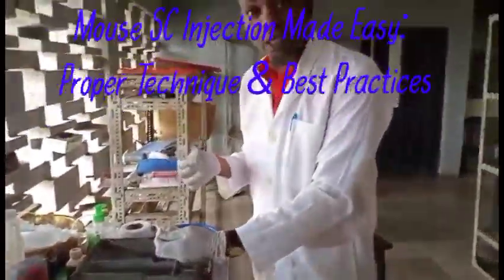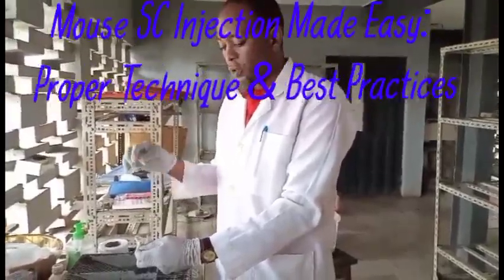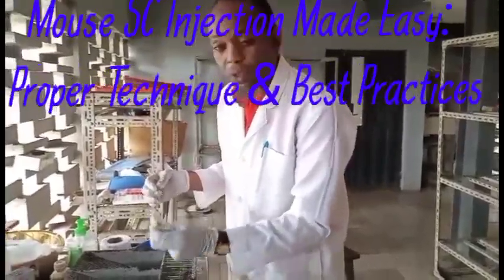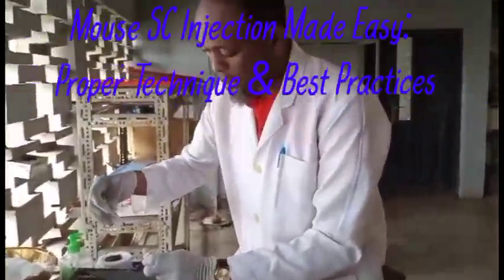Now in most cases, instead of suspending the animals like this, you can put your hand here if you have a shaking hand. Shaking hand is common among technologists, biomedical staff, students, and researchers. So if you know you have a shaking hand, you can put your hand on a platform. That will make your hand more stable. Then you administer the treatment.